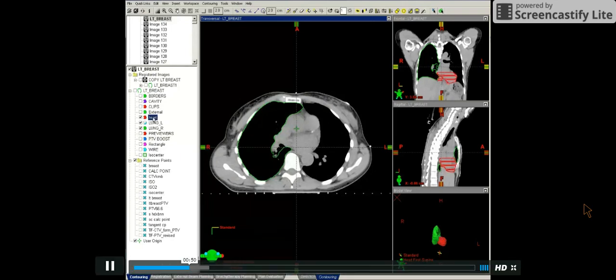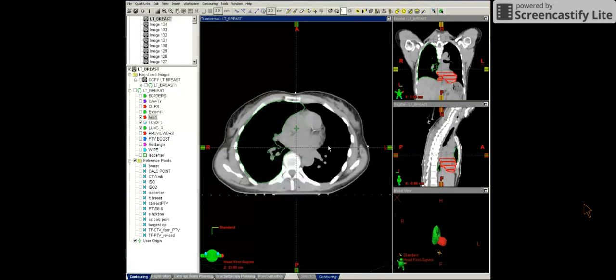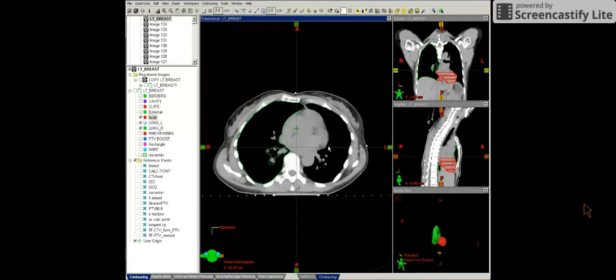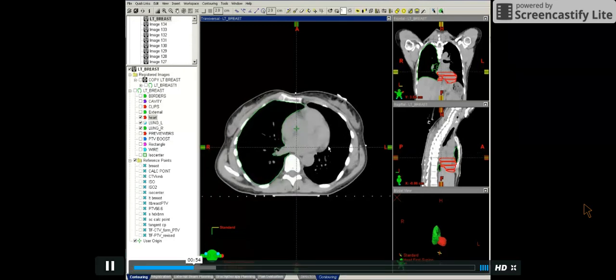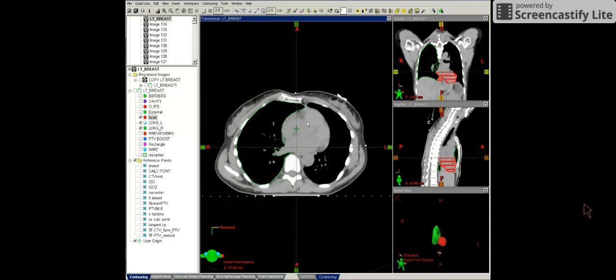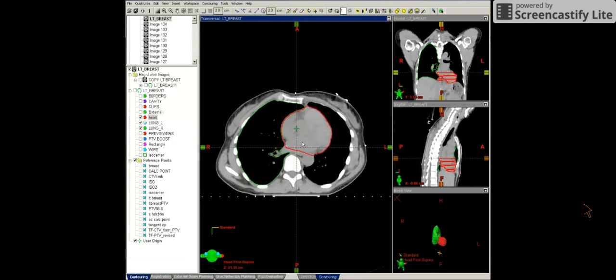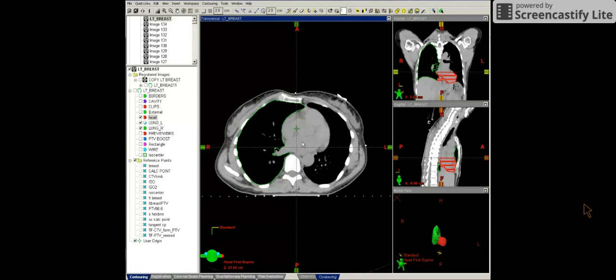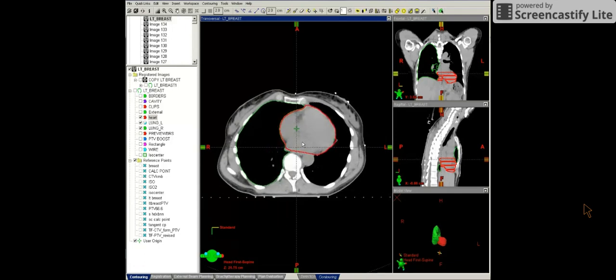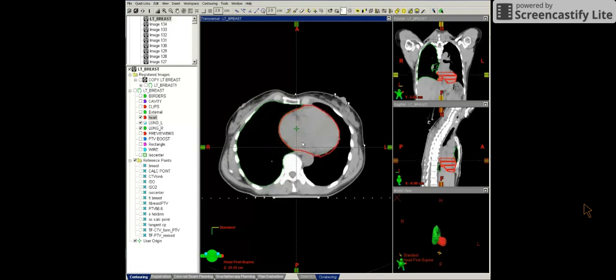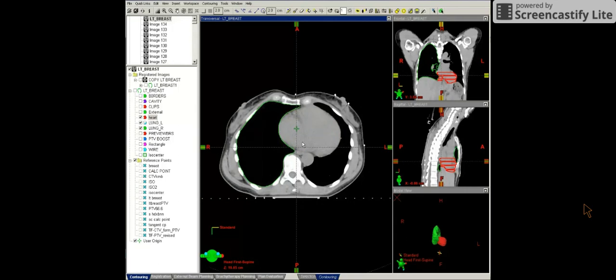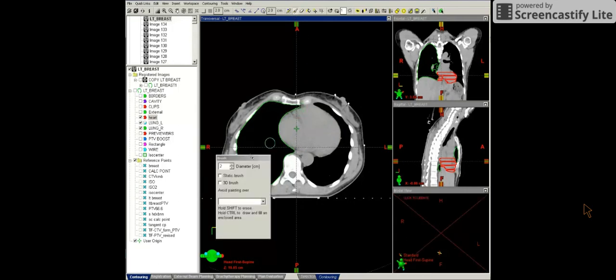And now let's go ahead and look at the heart contour. So at our institution, we contour the heart right where we see the last slice of the vessels. So this slice here would be the very first slice of the heart, right after we see the vessels disappear.